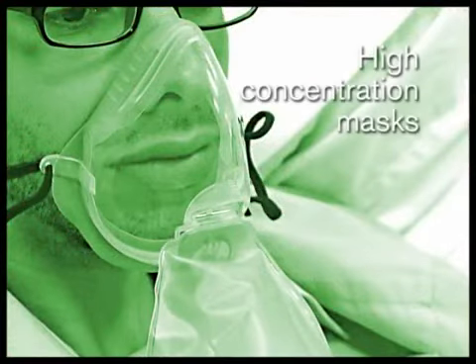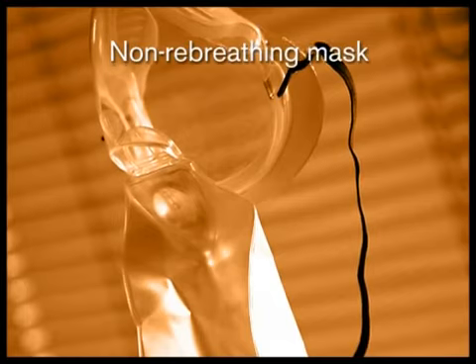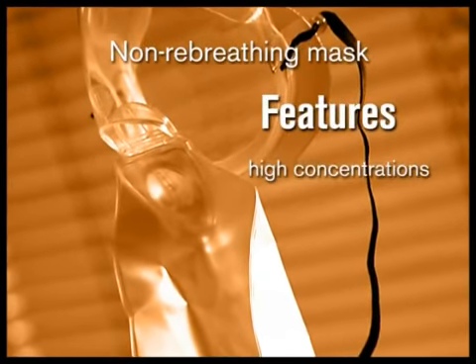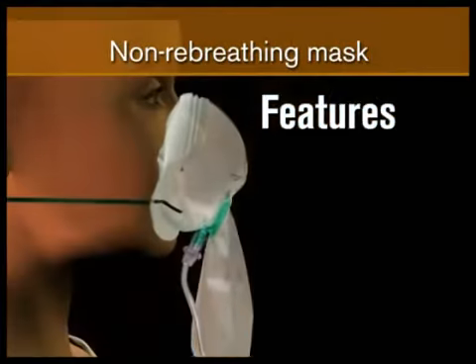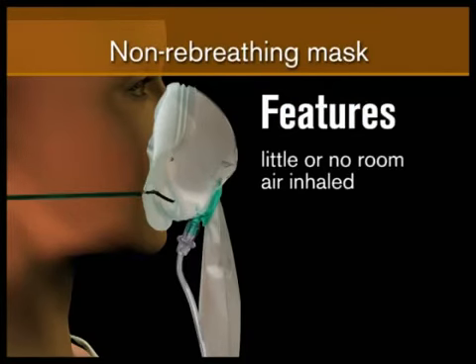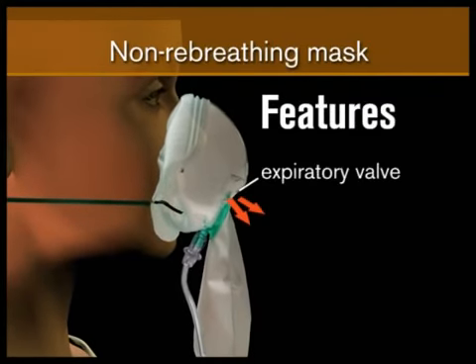High concentration masks. Non-rebreathing mask. This mask is usually used when high concentrations of oxygen are required, for example, with the critically ill or unstable patient. The patient breathes from the mask and the inspiratory valve opens so that oxygen is taken from the reservoir bag and the patient does not breathe room air. The patient breathes out through the expiratory valve.